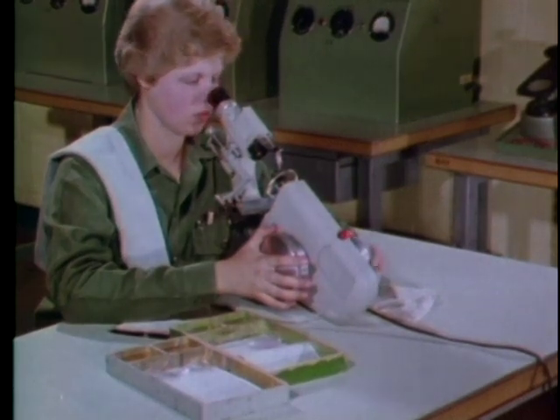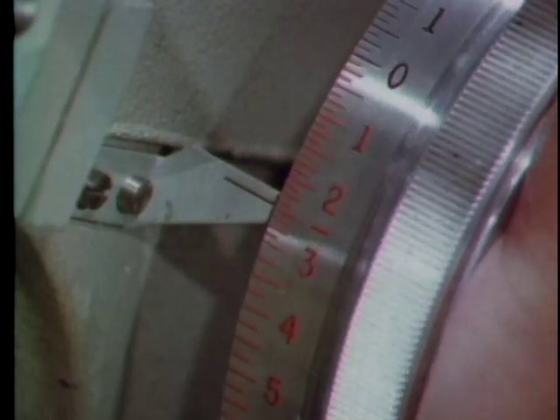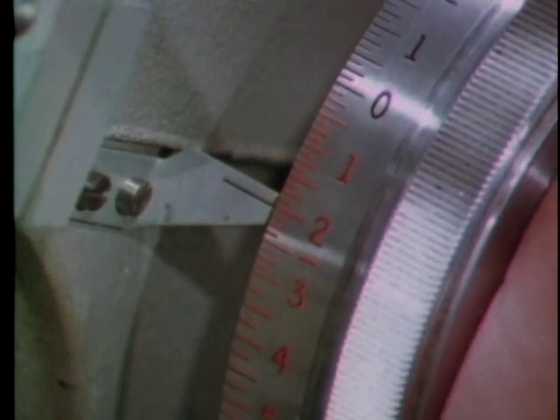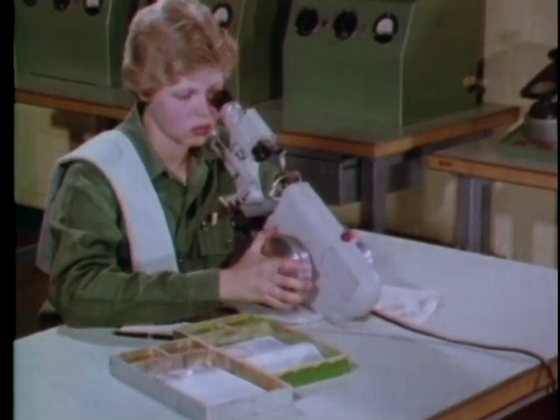Now suppose you do the same thing when the axis dial is set to 90 degrees. Here's how this movement looks through the eyepiece — neutralize again for the thin lines. This time you get an entirely different answer: minus two diopters. You must learn the correct step-by-step procedure for neutralizing cylindrical lenses.